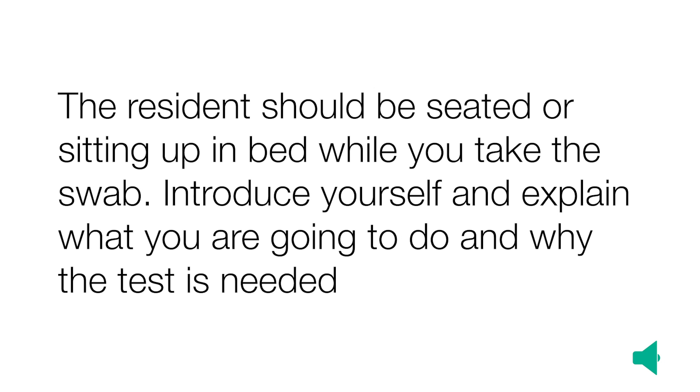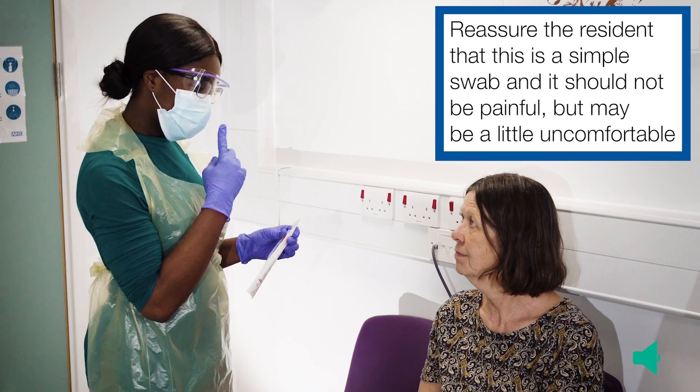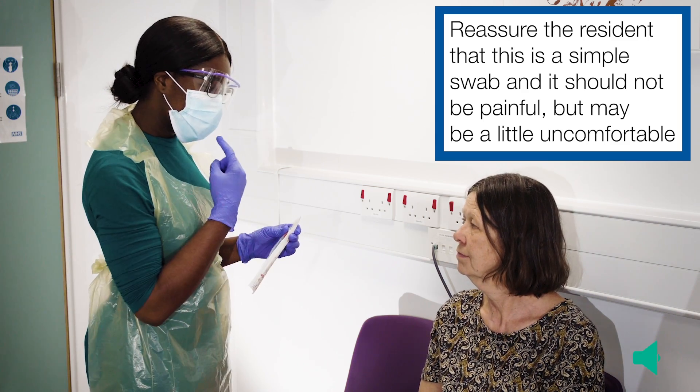The resident should be seated or sitting up in bed while you take the swab. Introduce yourself and explain what you are going to do and why the test is needed. Reassure the resident that this is a simple swab and it should not be painful, but may be a little uncomfortable.